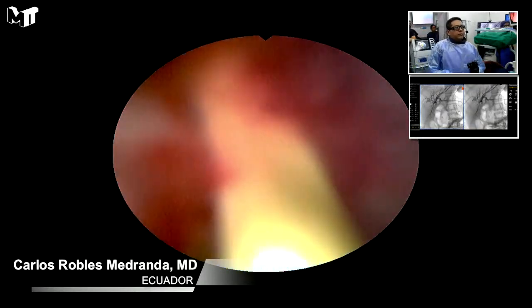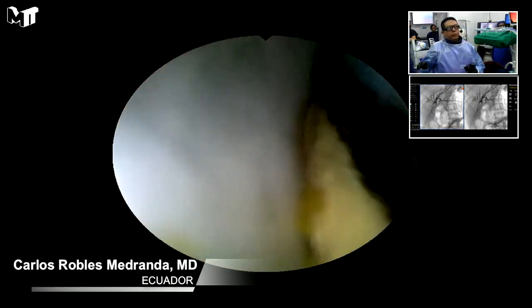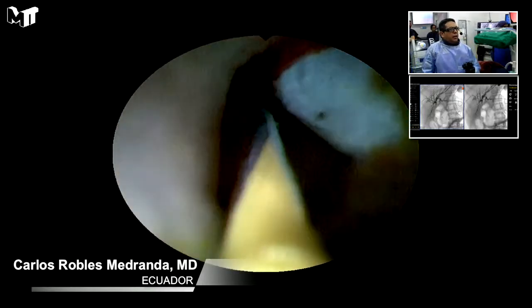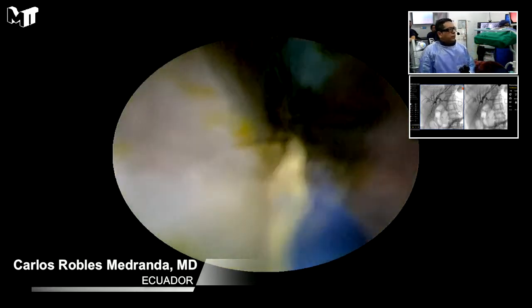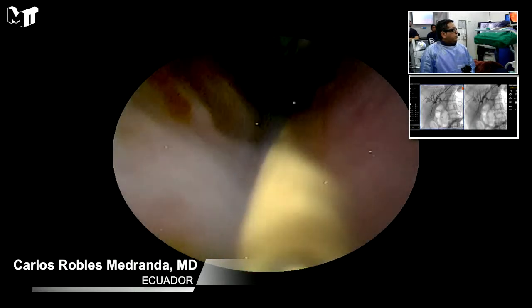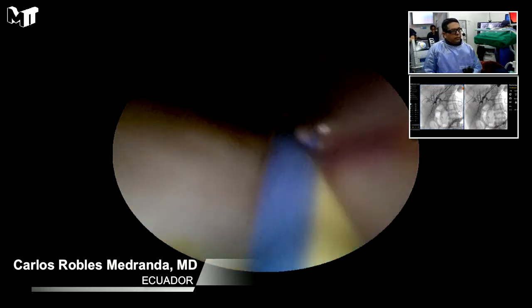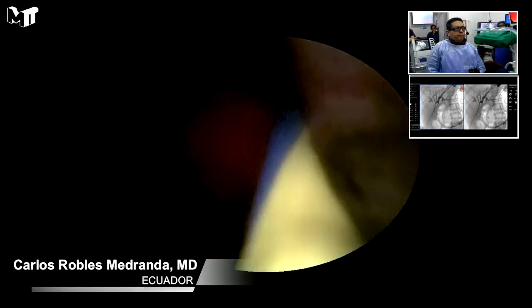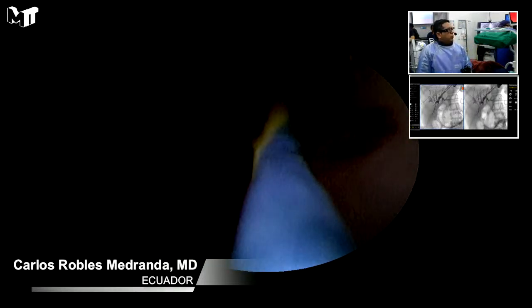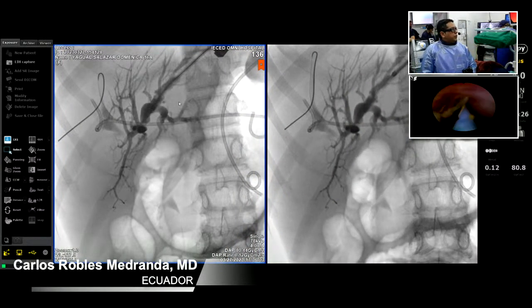Okay? So this is very important, just to leave in place one stent, and I need to pass now. Empuja, empuja. I will put the sphincterotome. Okay. ¿Quieres inyectar? Sí. Quiero inyectar allá. Déjame la siguiente. And then what I will do as a next movement is to remove the stent that I have from the right side to the stomach, and I will put just one stent. Okay?